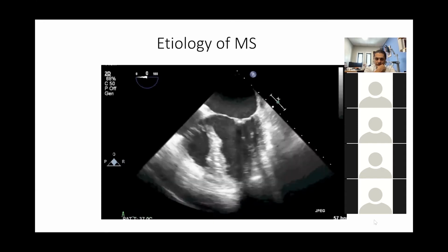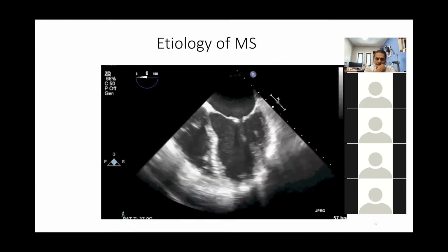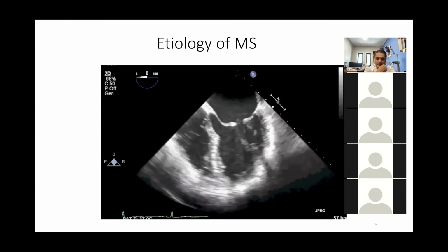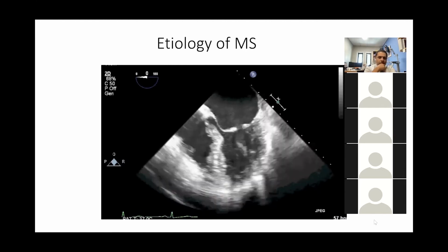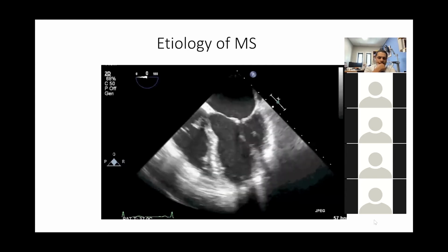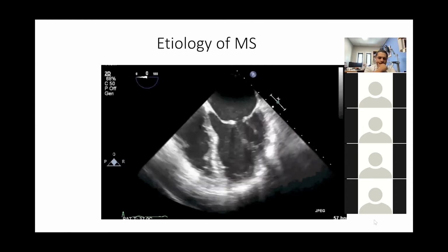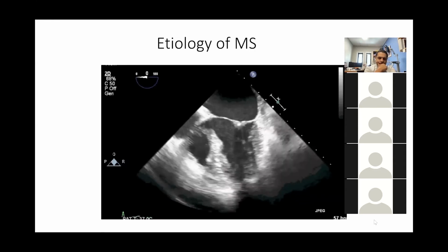I can see that the anterior mitral valve is giving that hockey-stick appearance. And there is calcification at the tips of the mitral valve, suggesting thickening of the tip. Is that the right terminology here? Yeah. So it suggests that it's a rheumatic mitral valve stenosis. Yeah, perfect. Thank you.